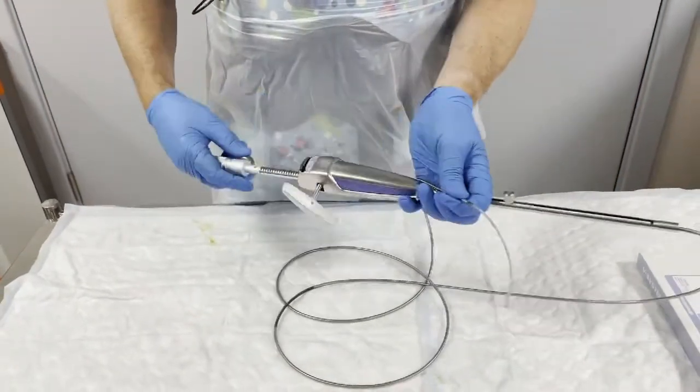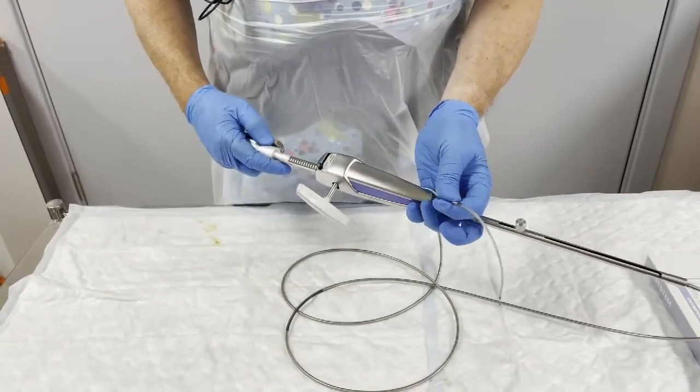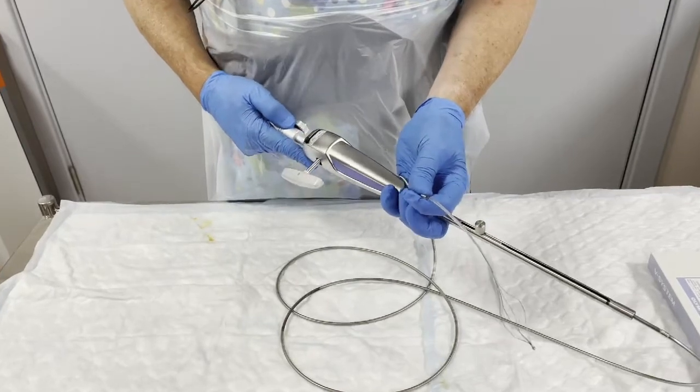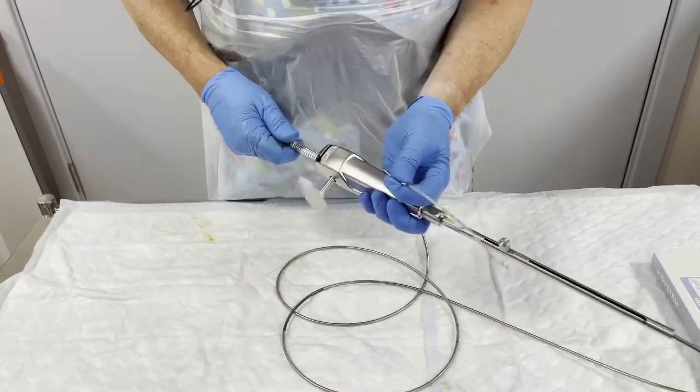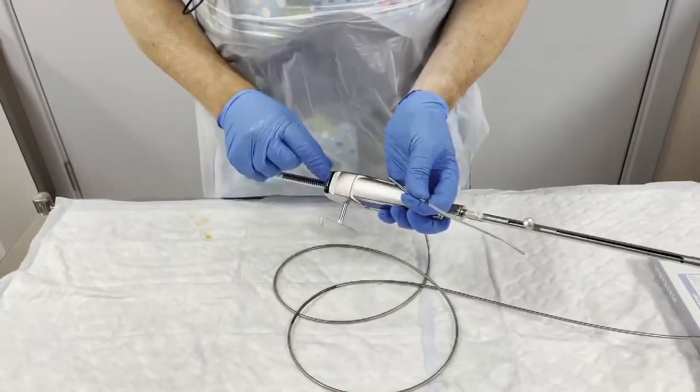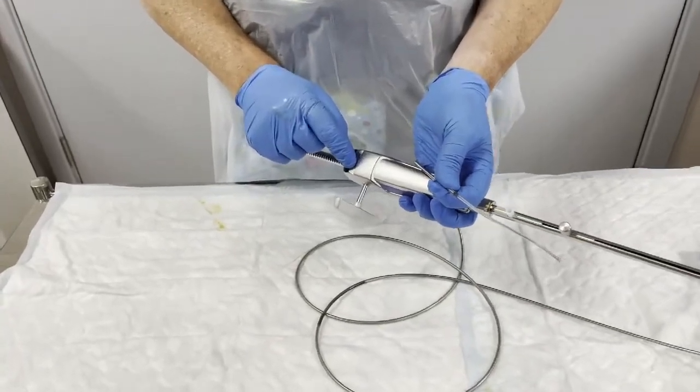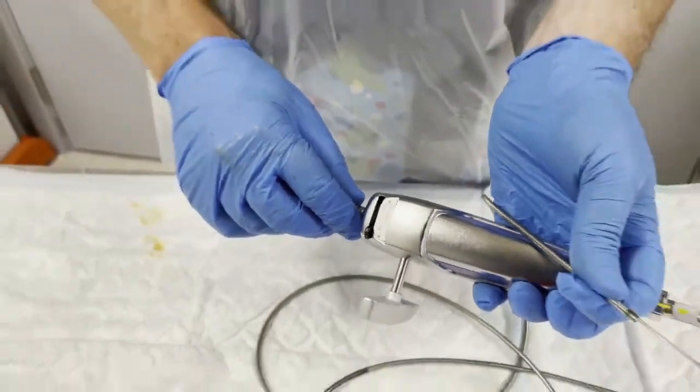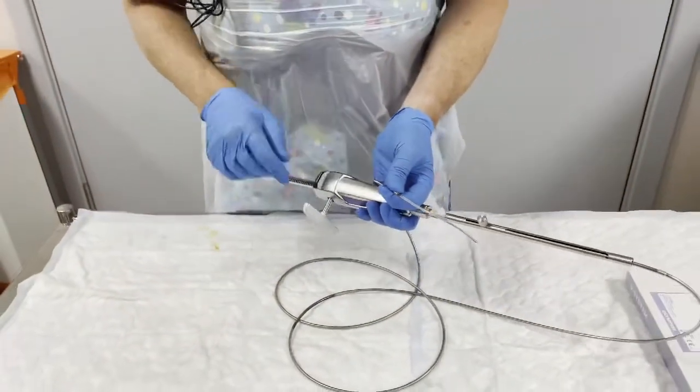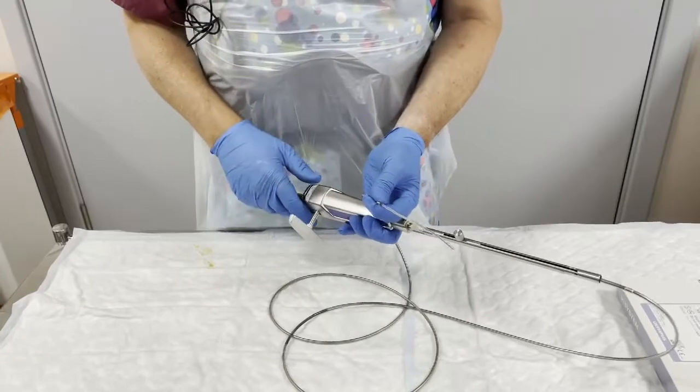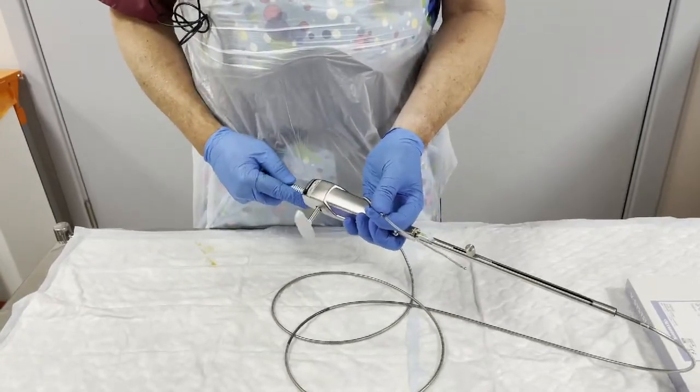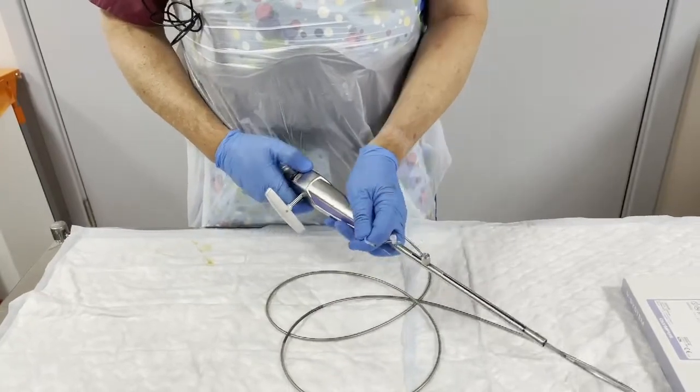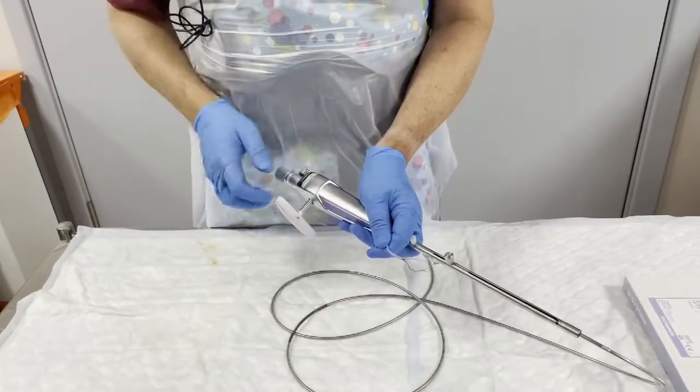And now as you can see, when I push the ratchet in, the basket opens and then closes. And at this point, we have the ratchet in the off position. Now in the example of the case you will see, the process is that one engages a stone in the basket.